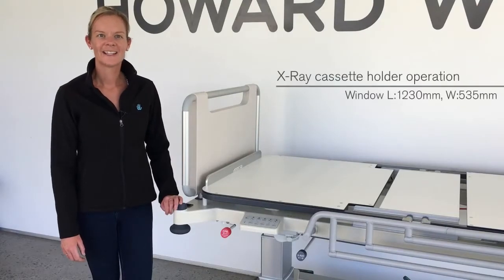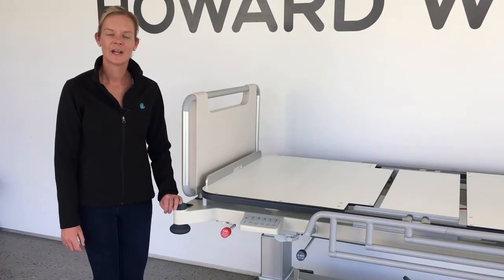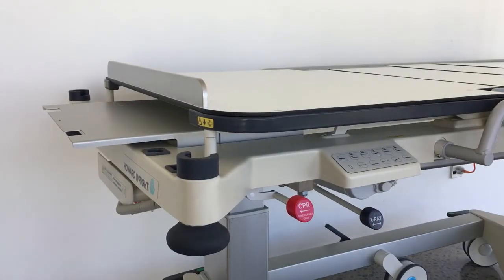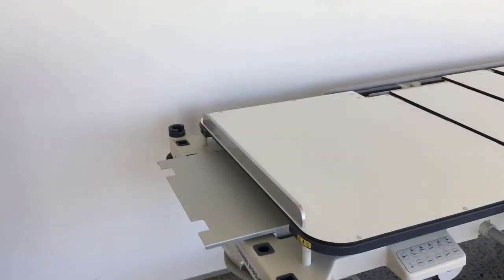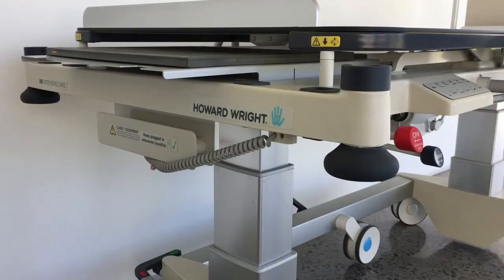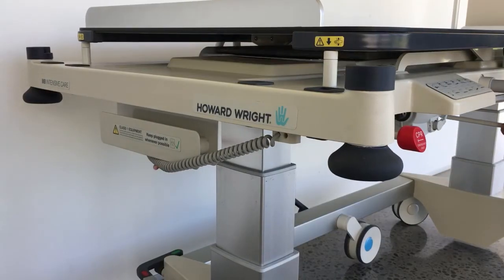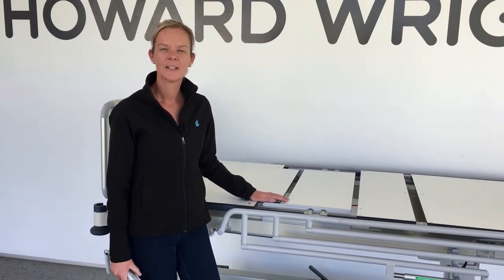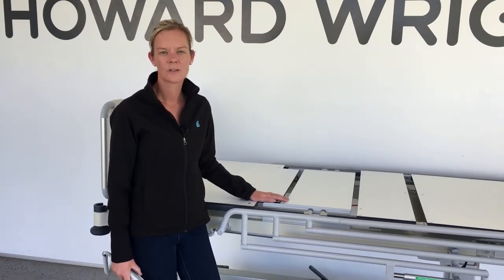A full X-ray cassette system is provided. Cassette positioning is achieved via an X-ray handle at either side. To load a cassette, remove the head bed end and move the cassette tray fully towards the head end. Place the cassette on the tray and position it beneath the patient using one of the X-ray handles. A C-Arm image intensifier can also be placed around the patient while they remain in bed; raise the deck to full height and position the receiver adjacent to the patient or according to procedure.